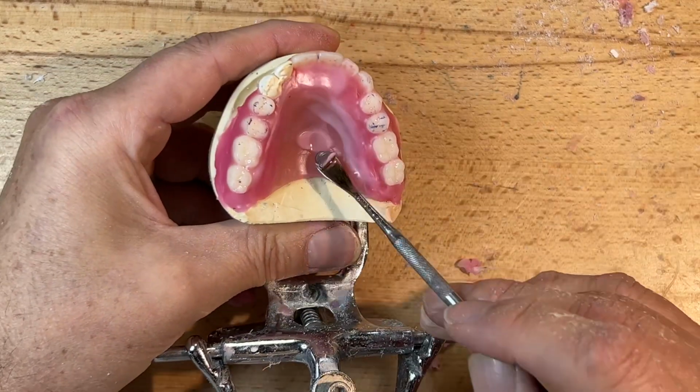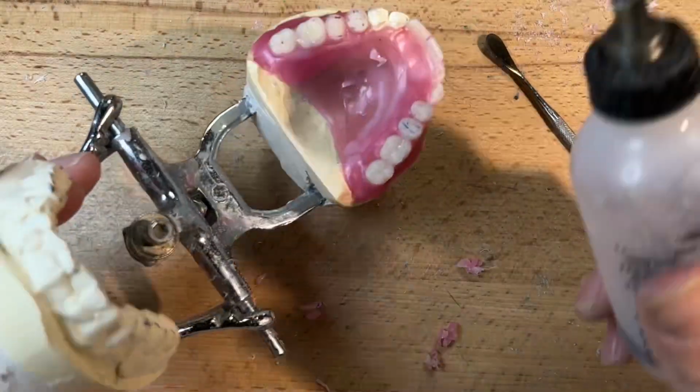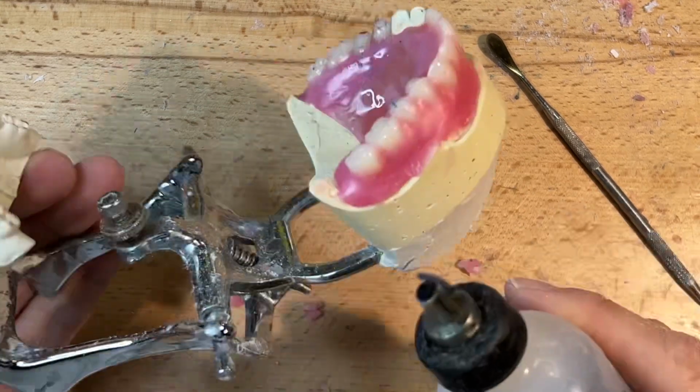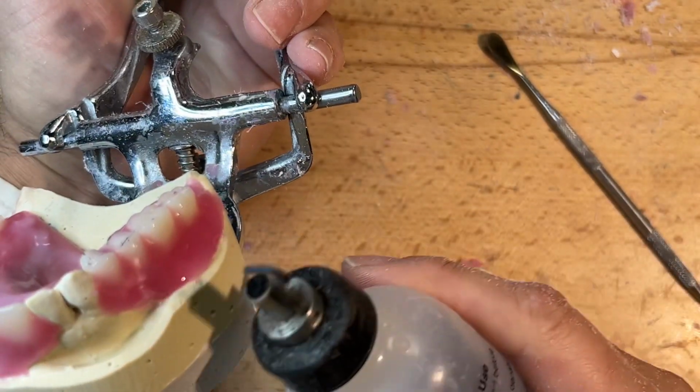And here I'm just adding some wax for my wax up. I didn't have to do much. Just smooth out the palate here. Make sure that I don't have any voids. Soften up the wax here all the way around. I think I have enough.